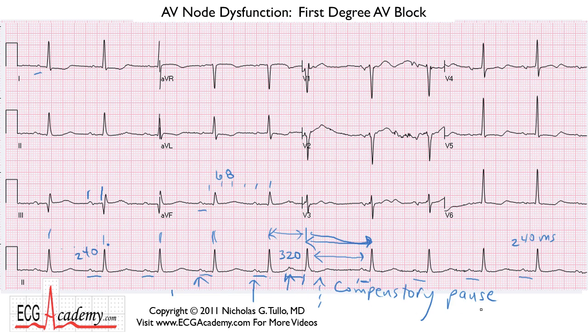So the reason I show you this is so that you understand that the AV node conduction time will vary depending upon how quickly the rhythm is, and that the AV node at a certain rate will fail to conduct every impulse down. That means you'll get AV block. But in normal people, AV block normally does not occur spontaneously. Although it's true that normal people, and especially people with healthy hearts, can sometimes exhibit brief periods of AV block when they're fast asleep. We can see that on Holter monitors, but that's considered somewhat normal in those patients.